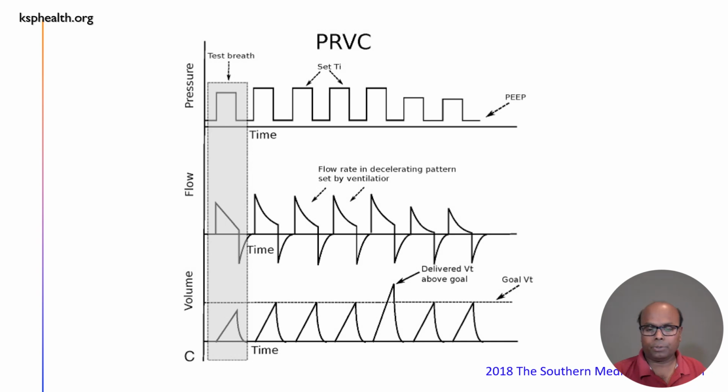It is very advantageous. It improves the patient-ventilator asynchrony, decreases sedation, decreases the length of stay, and decreases the mechanical ventilation, thus decreases complications.